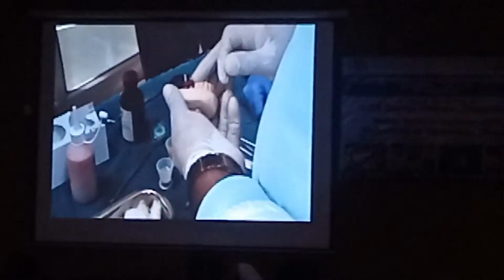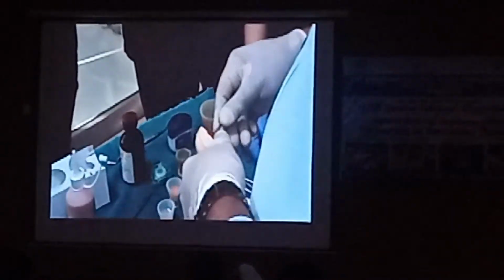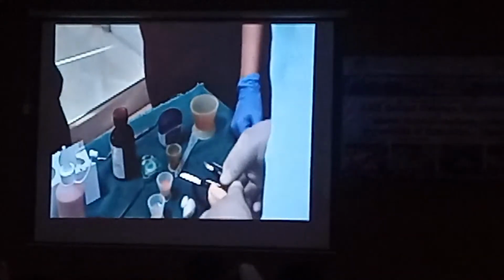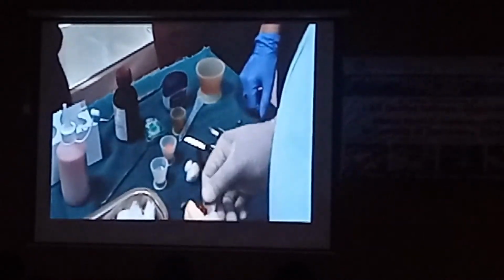So what we have done is we will be using a shorter screw. We will not change anything. We just change to the shorter screw so that I should be able to tighten it better in the patient's mouth. For the other one we have a shorter screw. Okay, we have one short screw. How do we manage with one short screw? No problem. Let us try at least with one short screw whether it is seating or not.